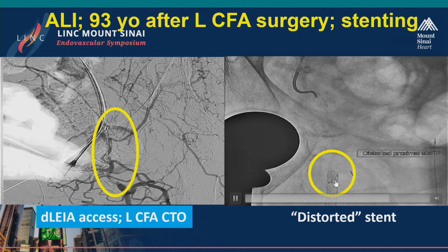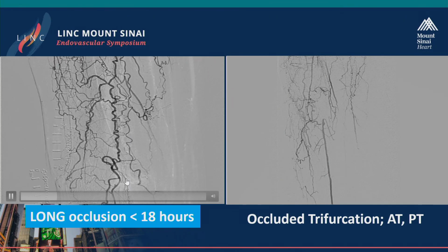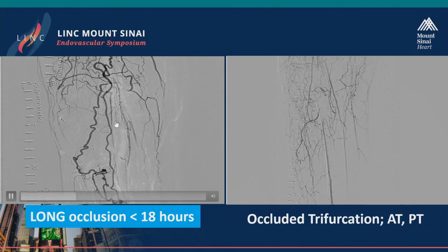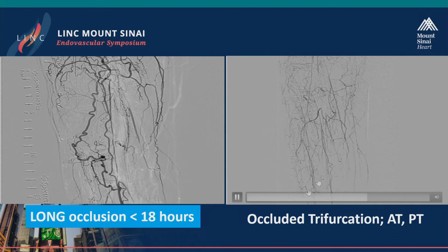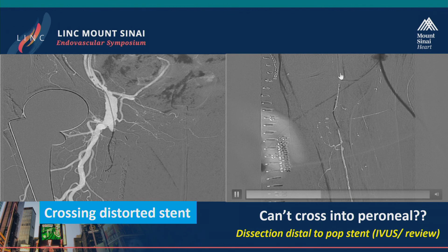Unfortunately, they had some issues with the stent, and you can see the distortion. And then the entire stents that were put in less than 18 hours ago were occluded, and it took out the AT and the PT. So we were able to get through there, but usually when you get through these stents, it's very easy. We could not, and what we found out with IVUS and looking at his films is there was a significant dissection they stented into.